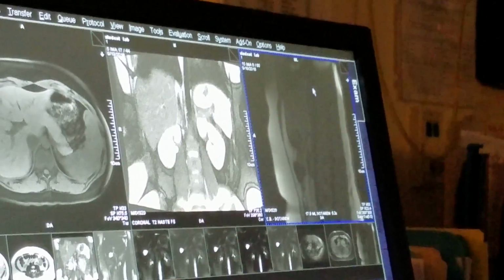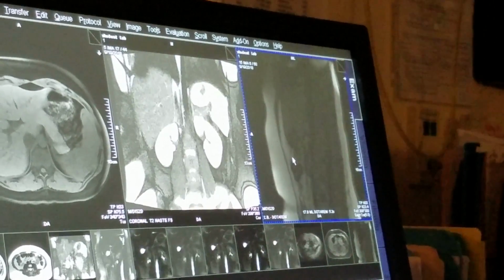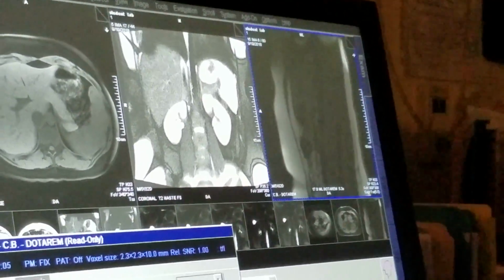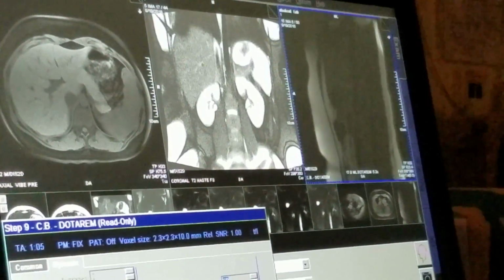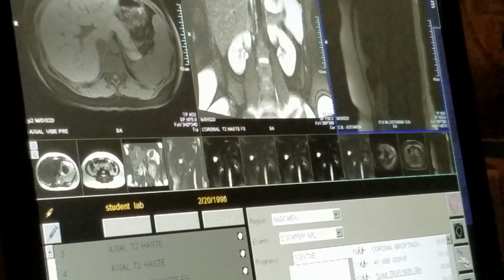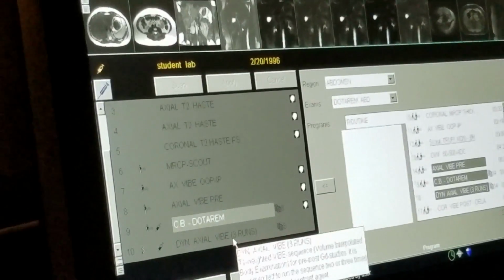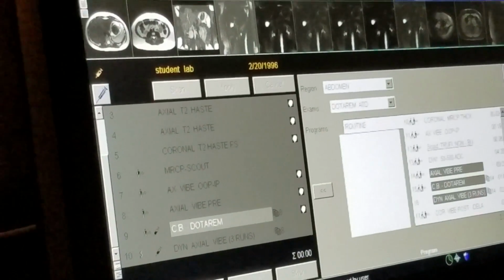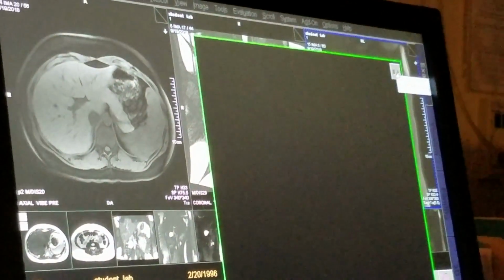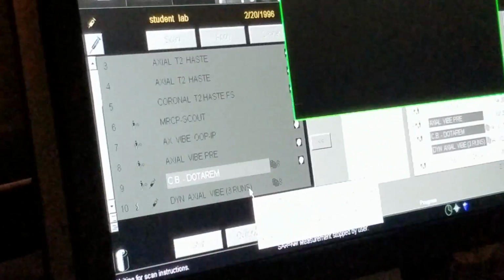That way, when the contrast fully opacifies the aorta, they've already stopped taking their breath in and are actually holding it. Okay. These care bolus scans are only set for, I think, like 60 measures. Yeah, 60 measures. So I just spoke for a minute while that was going on. So once it runs out, it's going to stop and start scanning your actual dynamic scans. If it were a real patient, we would have seen the contrast roughly in anywhere from 10 to 15 seconds. We would hit the stop and continue button, and then it'll immediately scan the dynamic scans.